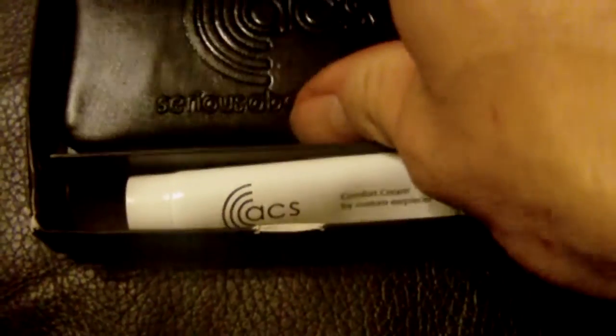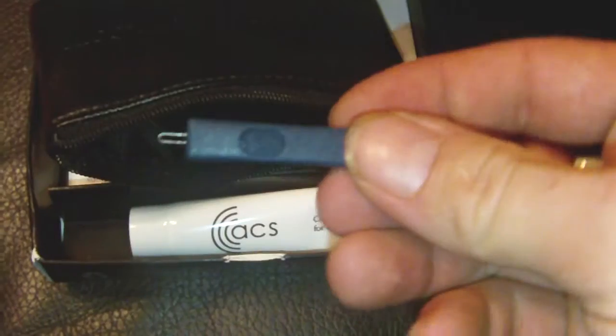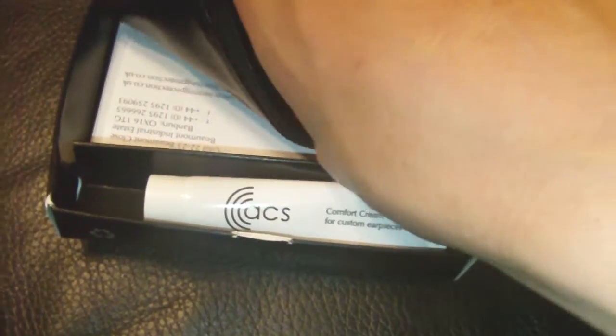Inside the box is, like I said, your comfort cream — you just spread a little bit on your plugs. You also get a rather nice leather pouch that they come in — don't know whether you can make the embossing out. Inside there is a rather useful tool: it's a wax pick, that's for taking wax out of the plugs if you've got any wax in them.